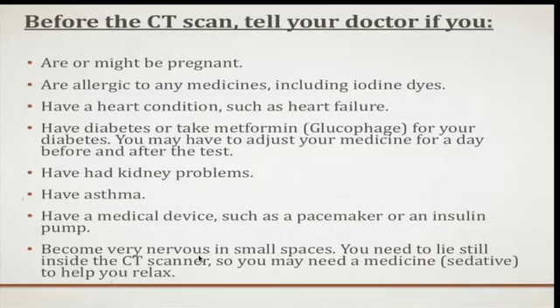And if the patient is claustrophobic, if they become very nervous in small spaces, because you will need to lie still in a CT scan. However, they don't need to lie still for a long time as they do in an MRI. So usually we can get a CT image from a claustrophobic patient, but an MRI would be a challenge. Sometimes we might offer a sedative to help these patients relax, okay?